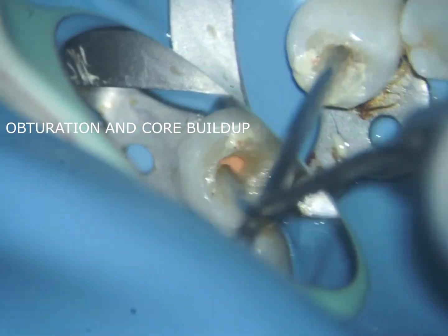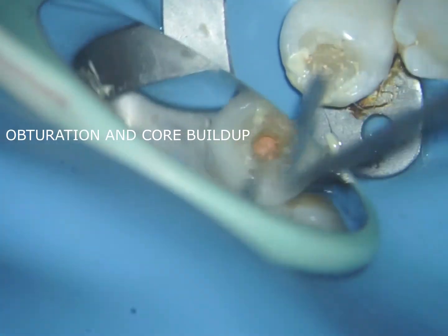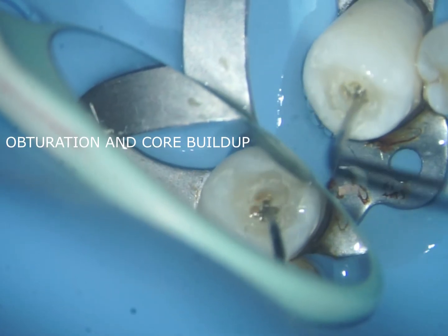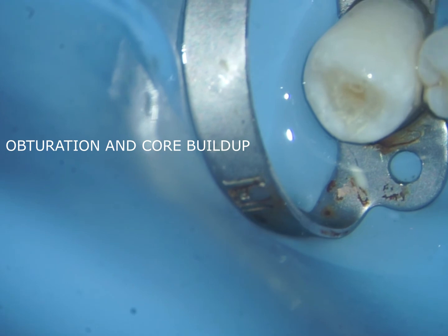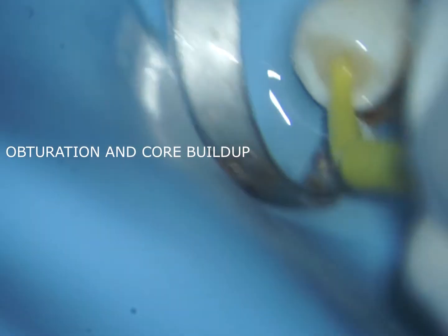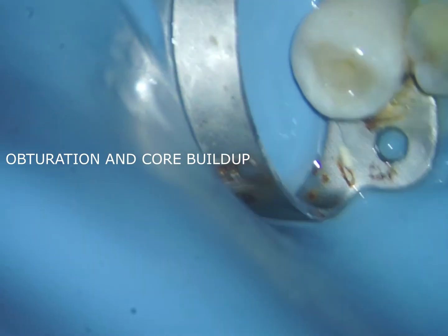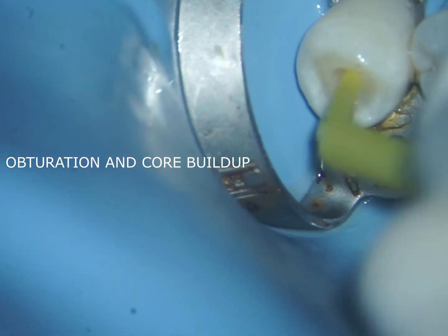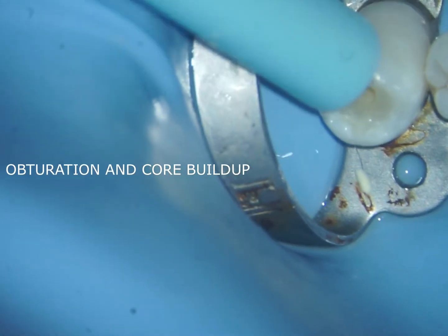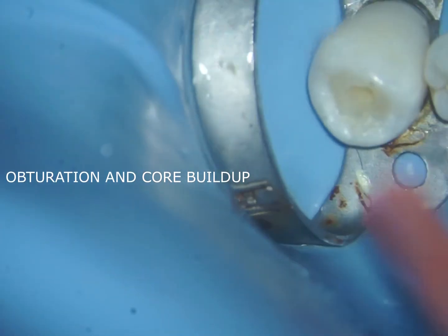We use canal clean — basically alcohol — to clean off the coronal thirds of the chamber. We use a small applicator tip to brush off excess sealer from the walls. We've pooled 95% alcohol into the coronal thirds and are scrubbing with a micro-brush to get rid of all the root canal sealer inside the coronal thirds. We'll then wash it with water and follow the bonding protocol.